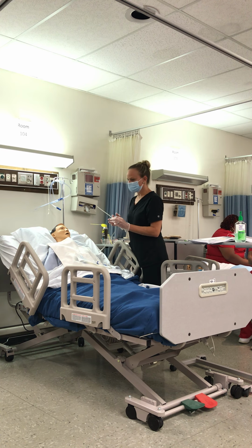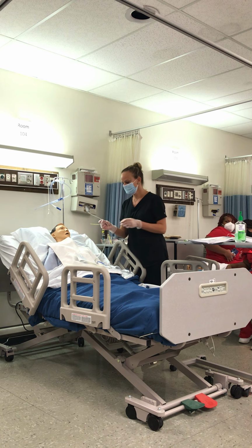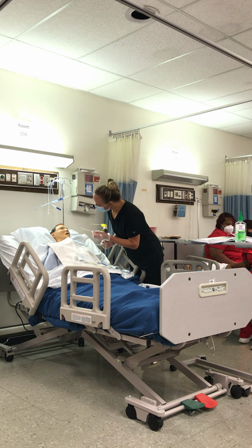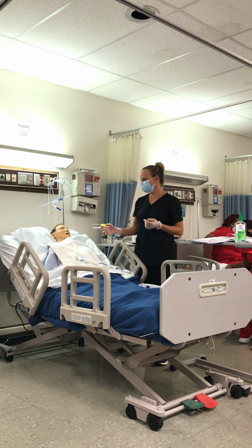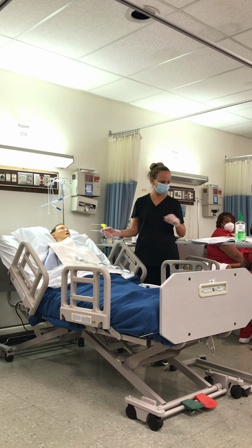Alright, so now again, I would go through that process of explaining, right? Let them know what we're doing. And then, what is our next step as far as what position they need to be in and how we need to pass this tube?